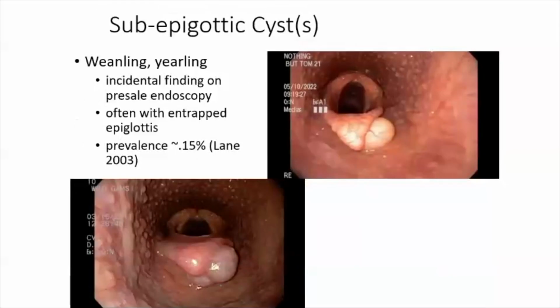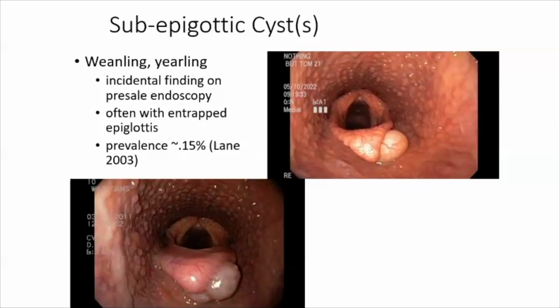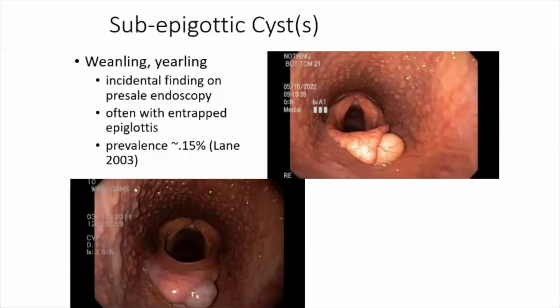Sure. Okay. Got the last slide? We've got one more. These are just a couple more examples of subepiglottic cysts. Interesting, one in the bottom left. Yearlings or young horses with subepiglottic cysts oftentimes will have an entrapped epiglottis with it, which is the example on the lower left. It actually has 2 cysts there, if you see it. The one on the right is actually a 2-year-old, I believe, that had a cyst but was not an entrapped epiglottis also. And those can be lasered. Some people try to do it through the nose, but it's so much easier to work through the mouth with the horse anesthetized, using a laser and some instruments, and you can remove those cysts. Okay, good.